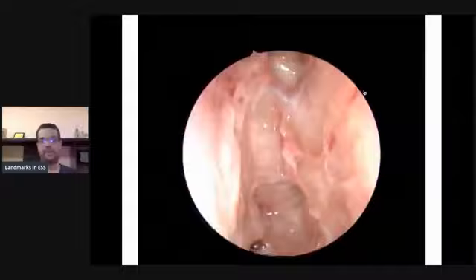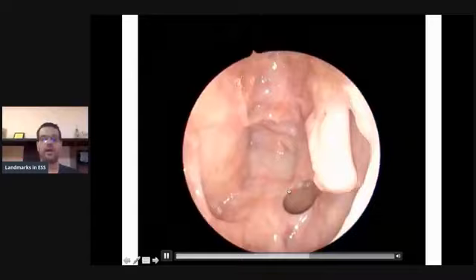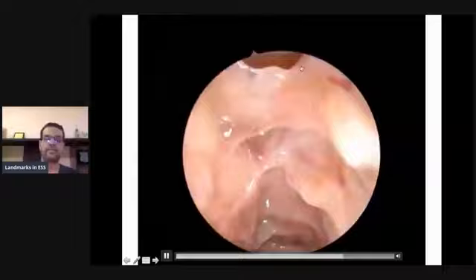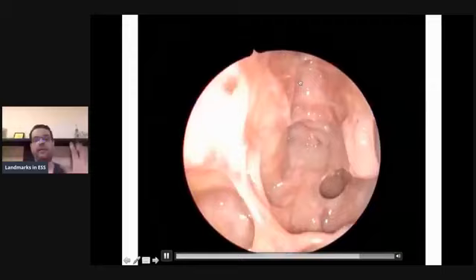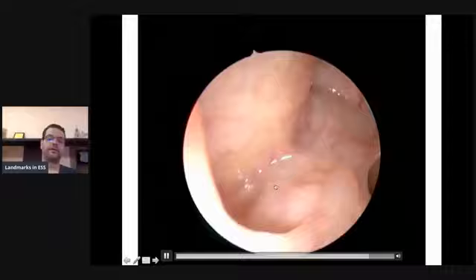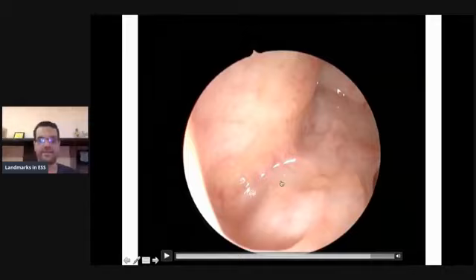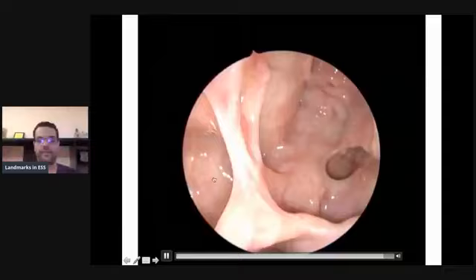In a separate lecture. Again, on the other side now, we have the sphenoid sinus, the superior turbinate upper two-thirds. We have the skull base, a band here. See, this is the anterior ethmoid artery, a band in front of the anterior ethmoid artery that I have missed. But unfortunately, you don't have any complete partition that's going to harbor disease. Again, the retromaxillary cell, you can call it Herzallah cell. I like that name, of course. Again, that's the cell, and then the middle meatal antrostomy.